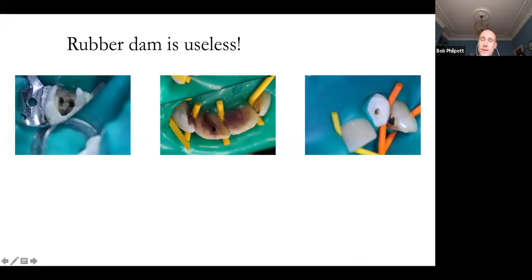The other thing is, if the rubber dam is riding up onto the palatal or the lingual surface of teeth, and I'll talk specifically about mandibular lateral incisors later. If it's doing that, and I always say this when I talk about these images, one of two things will happen. In a best case scenario, you will access and you will keep going and keep going. You'll identify that the rubber dam is in the incorrect position, and you will either pull it down with your fingers or you leave it there and the burr will catch it and give you that shock where you jump back.